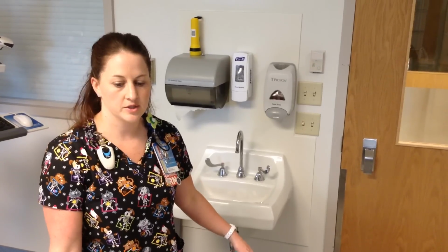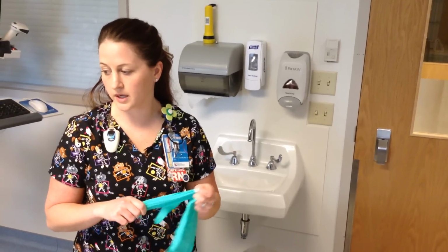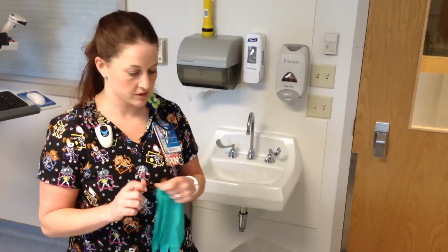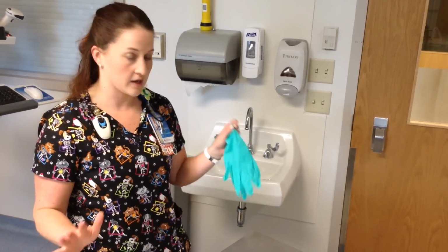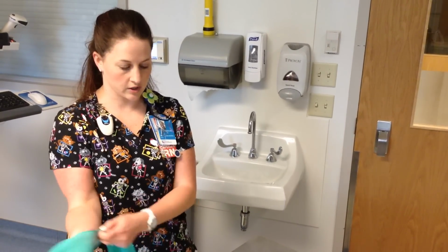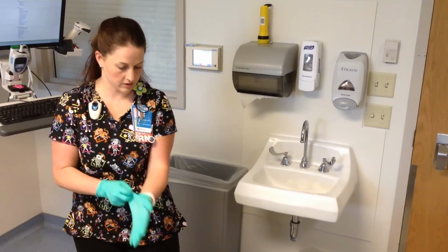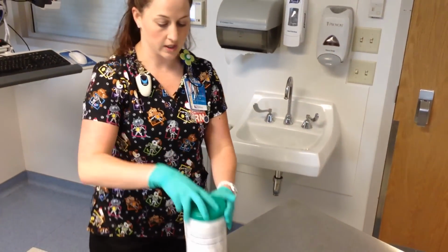We are going to demonstrate a 3M PICC dressing change with step-by-step instructions. So initially you're going to enter the room, you're going to have your stainless steel cart, and we are going to clean our cart. And always make sure that we're using our stainless steel carts as our work surface.